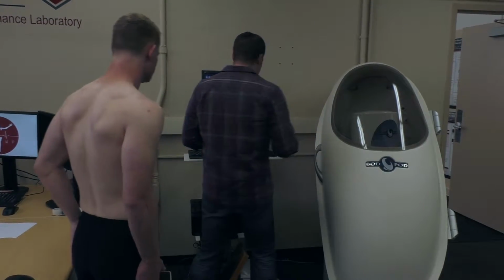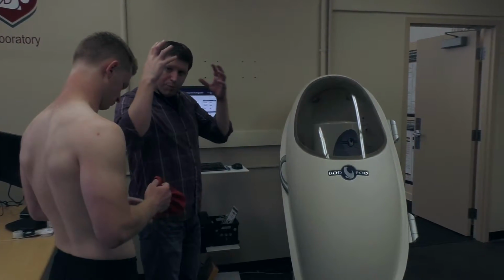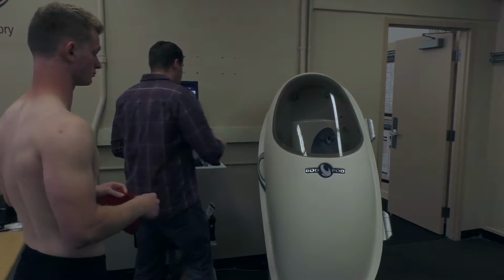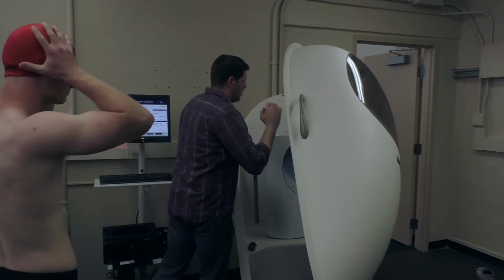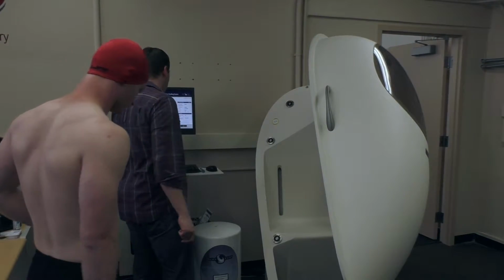And we are just about ready to go. We're going to ask him to put on this sort of lycra hat here that compresses any hair or hair volume that they have. Again, that's very, very important that we minimize that. So now we can take out our cylinder here, and we can ask the individual to enter the bod pod.